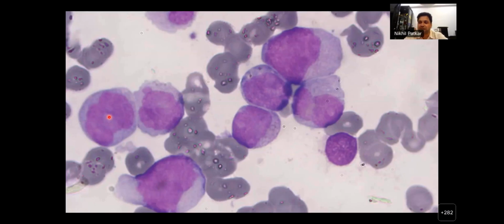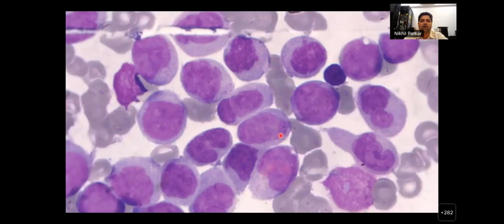It's okay in a seminar, surrounded by many people where everybody has looked at the slide. But if you are alone in your practice and you're reporting this smear, or you're on duty as a resident and you're seeing this smear, it can be very terrifying, I assure you. Okay, so again, you have all these curved, indented cells, but you also have these. Now, what are these?